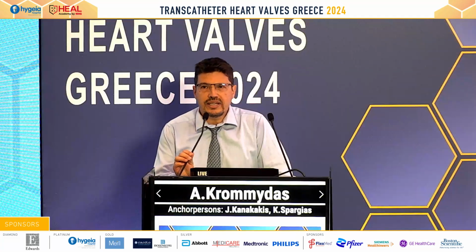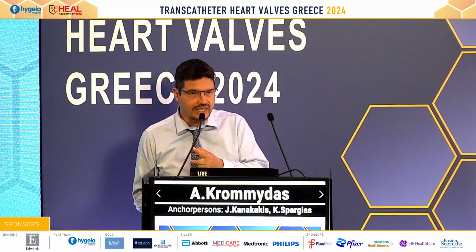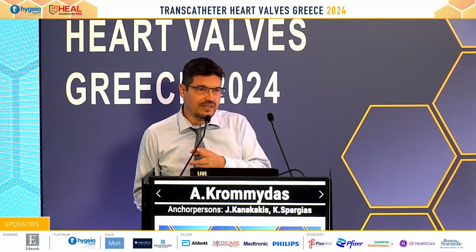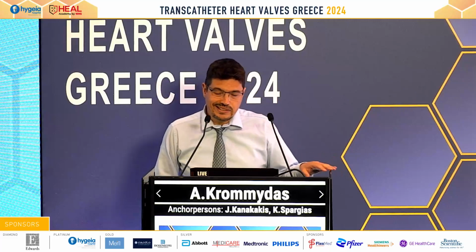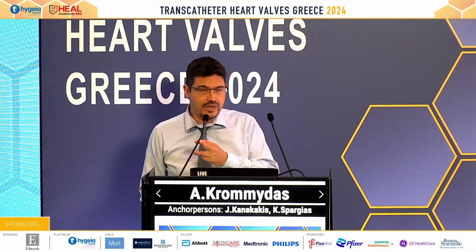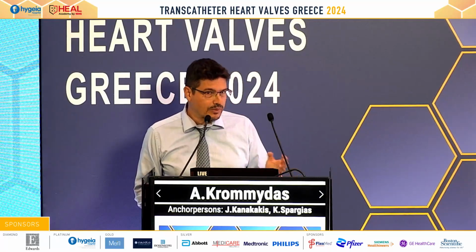It's a very good question. In the beginning of TAVI, this was an important step of the procedure, but afterwards, because of the planning of the TAVIs, the good imaging from the CT, they get all the measurements and the data from there, and most of the times they have all they want for the procedure. Of course, there are always some cases where they may ask us urgently to assess a complication during the cath lab, any pericardial effusion, any rupture, but most of the times it's not needed. We as echocardiographers always want to help and get a vision of the valve, but most of the times it's not needed.